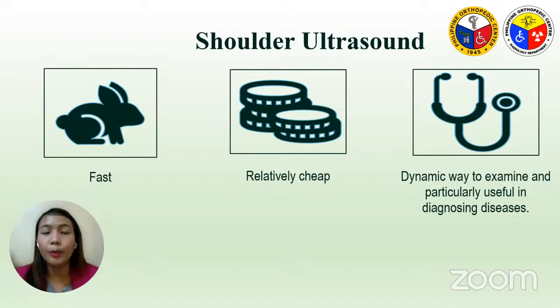To evaluate all potential causes of shoulder pain, it is preferable to follow a standardized protocol and perform a thorough evaluation of the shoulder. In addition, a thorough dynamic study can improve the diagnostic accuracy of the ultrasound, particularly when the pathology is not revealed by a static evaluation.